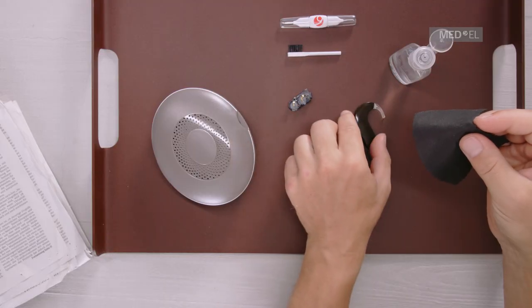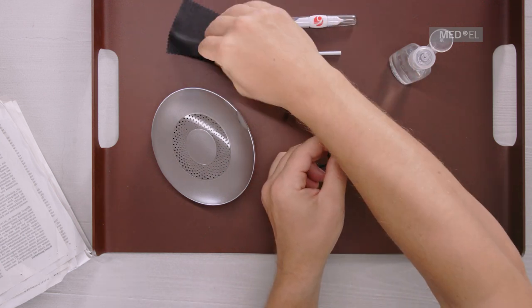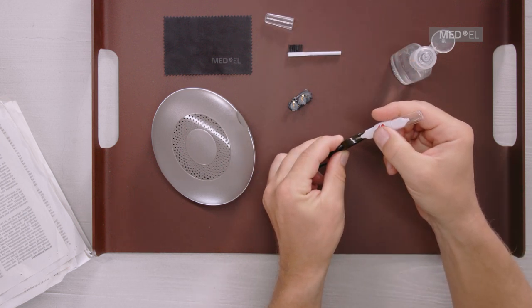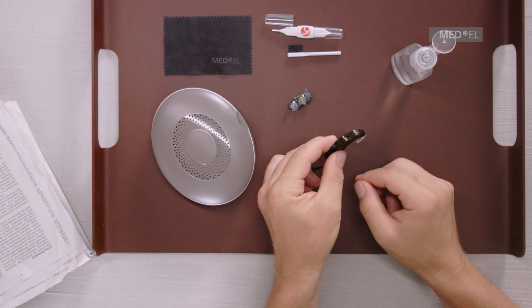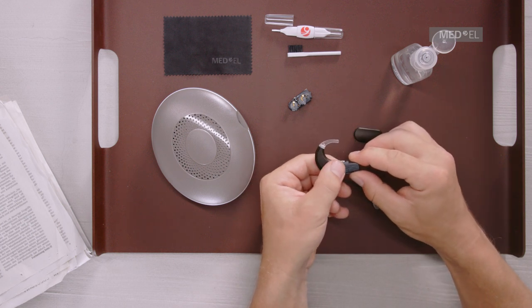If the microphone cover gets wet, wipe it dry or replace it. You should replace the microphone cover every 3 months, or sooner if it appears dirty or if sound quality has worsened. Use the drying kit every night to allow Sonnet 2 to dry out completely. Before placing the audio processor in the drying kit, you must remove the disposable or rechargeable batteries.